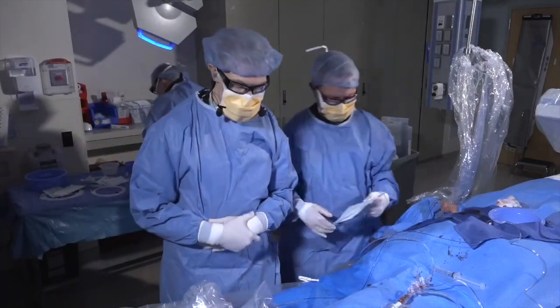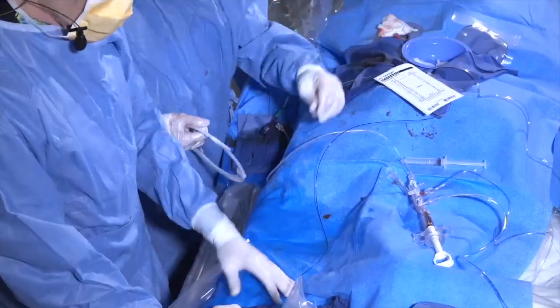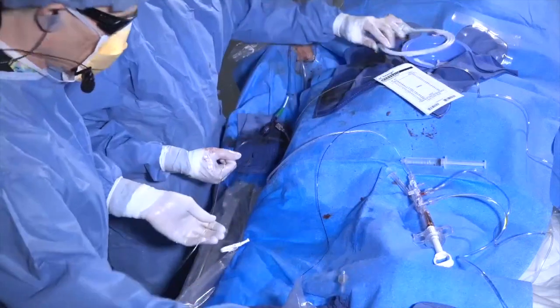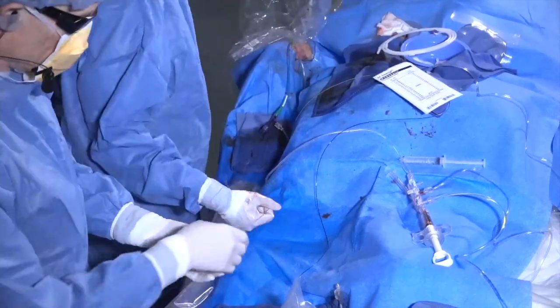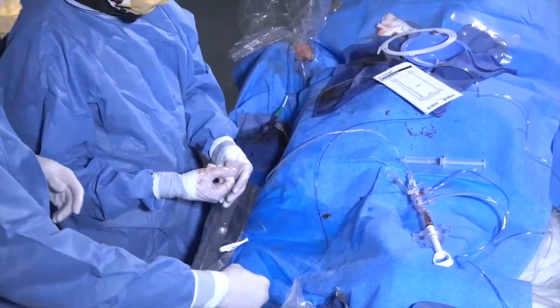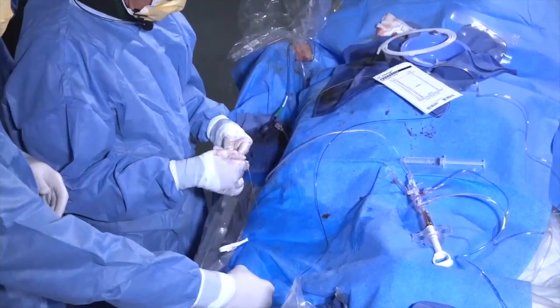I also think the advantage of 7 radial is quite good, because you can do simultaneous stents as long as they're not very large, and you can get the 1.75 burr. And the 7 slender sheath really is pretty well tolerated by most people. I mean, she's very petite, and the 6 is quite easy in her. Yeah.